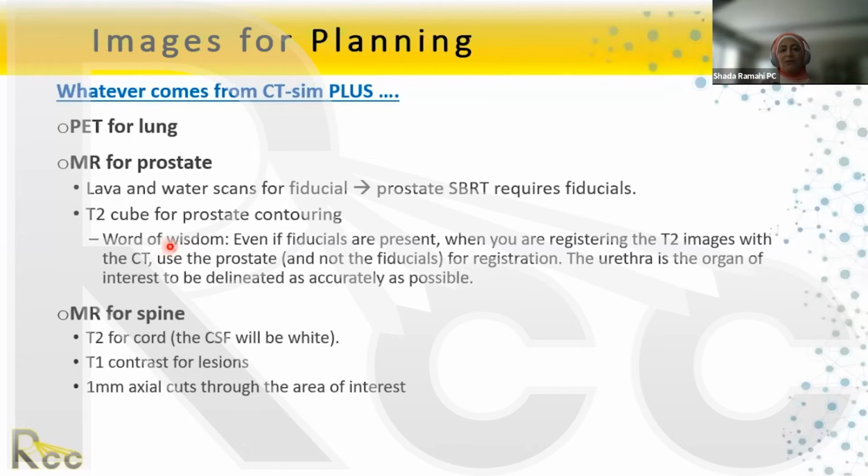CBCT quality is already worse than a CT sim. So you will have an extremely hard time finding the prostate on a CBCT. In this case, you only have to depend on the fiducials themselves, right, to align the patient on the table.